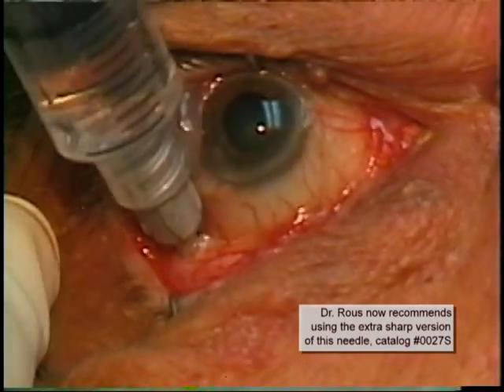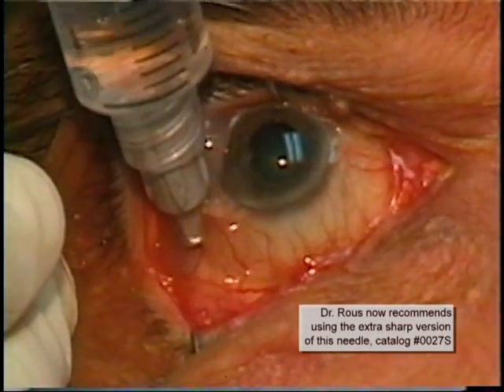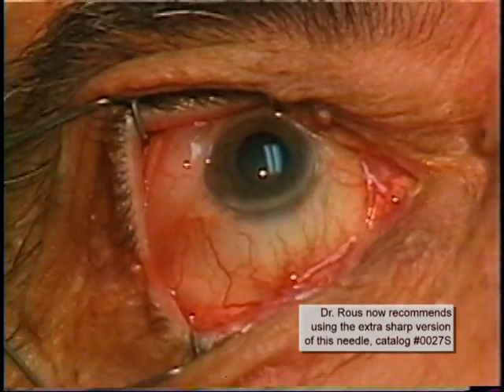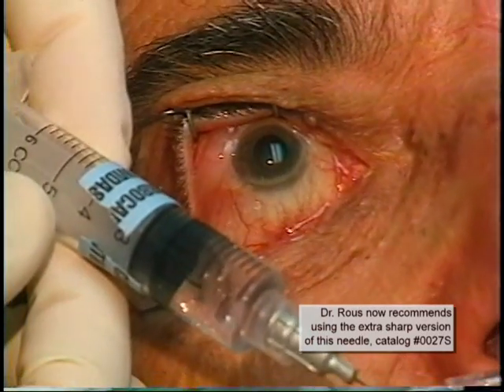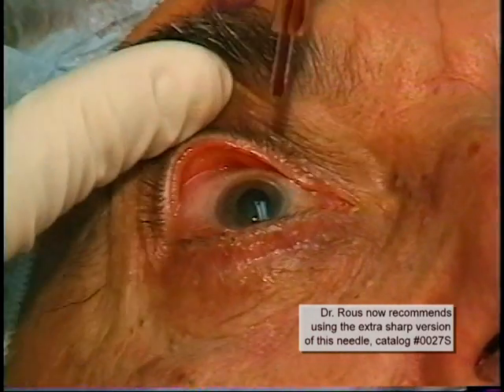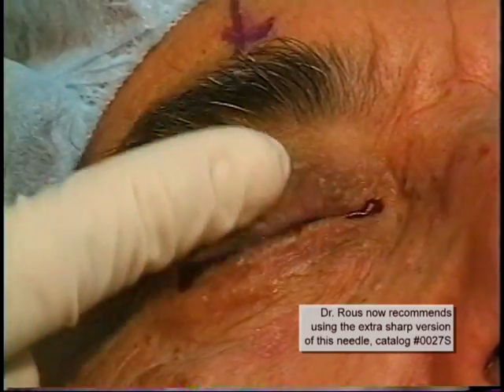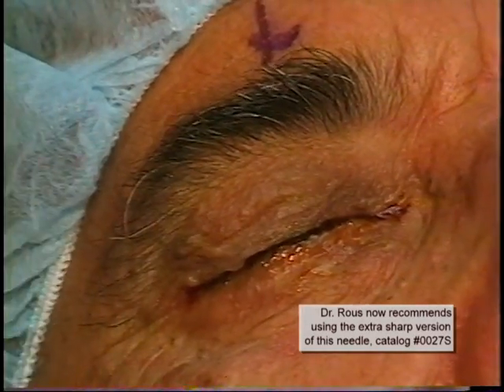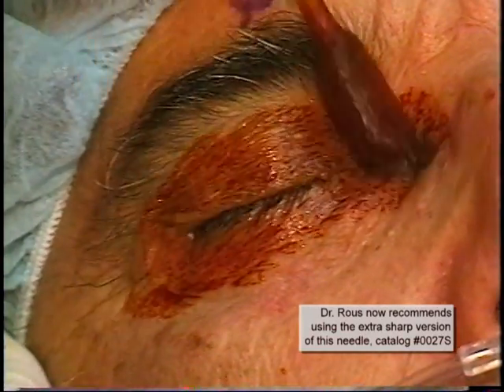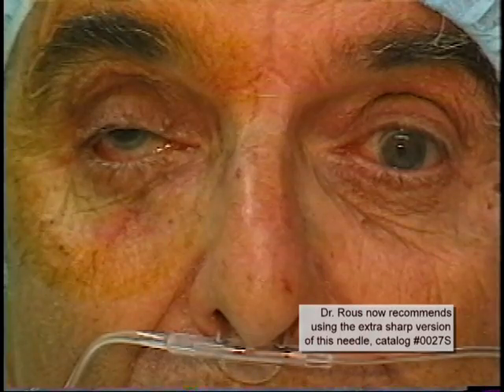In this patient, only three cc's of the anesthetic was injected, since there was sufficient parabulbar spread. As was done in the first patient, betadine 5% solution is instilled onto the eye. Betadine 10% solution is swabbed over the lids, and a patch and Honan's balloon will have been placed.